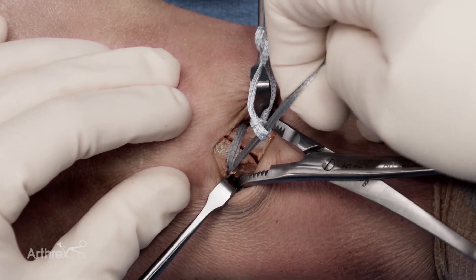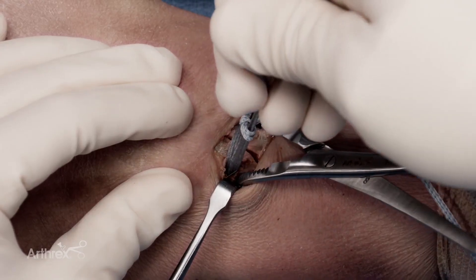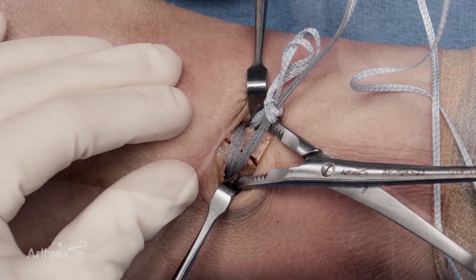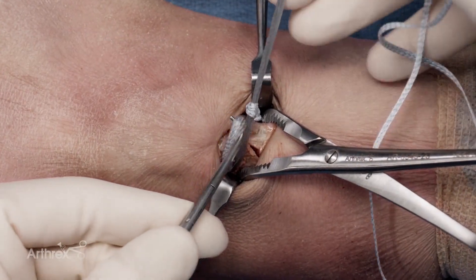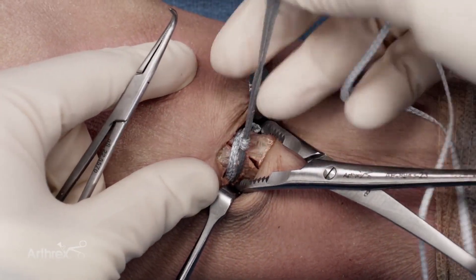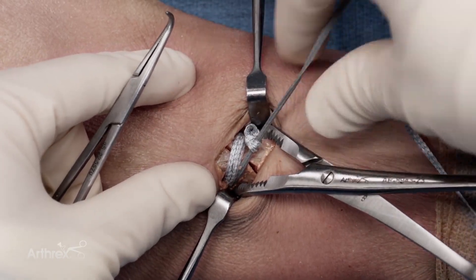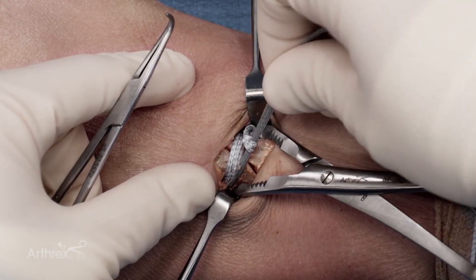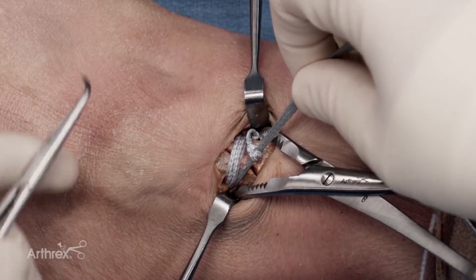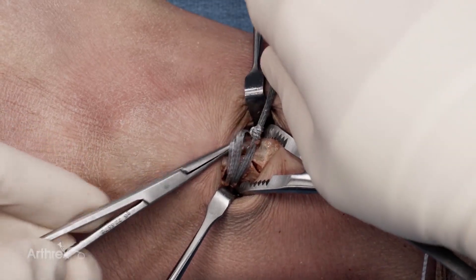If you have any trouble overcoming the frictional forces, you can use a hemostat underneath the first pass to help. Getting the excess out of the way will also facilitate fully bringing the racking hitch down. One thing to note is that you're eventually going to have a knot here, and it's better to have that knot more anterior so it does not bother the peroneal tendons. I'm going to purposely bring that knot more anterior, which can also be facilitated by a hemostat or a right angle.